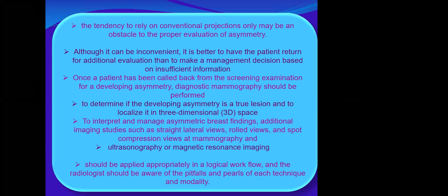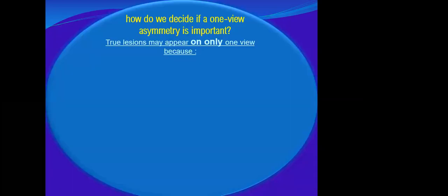We'll go through this as well as ultrasound, tomosynthesis or magnetic resonance, you see? And we should apply them appropriately in a logical workflow, and radiologists should also be aware of the pitfalls and pearls of these techniques. We cannot put it like that, when you have to do this, second you have to do that, no. It depends on the case.